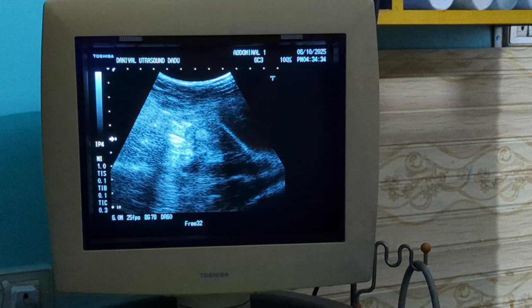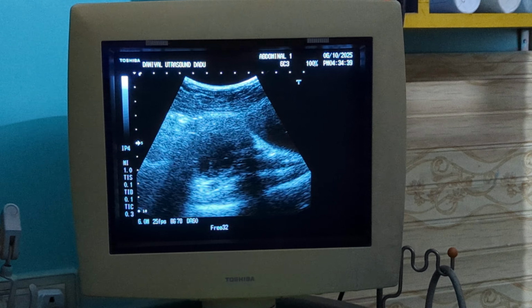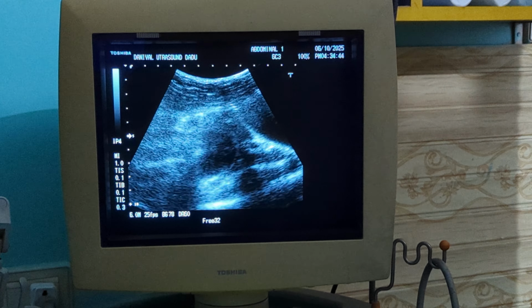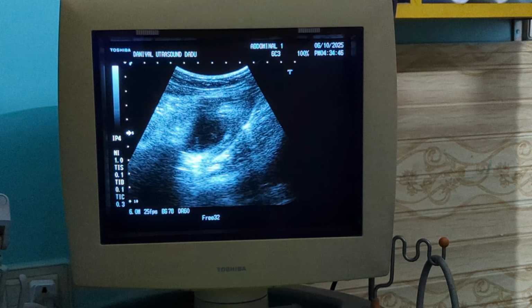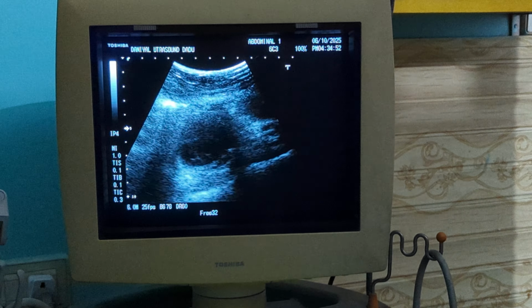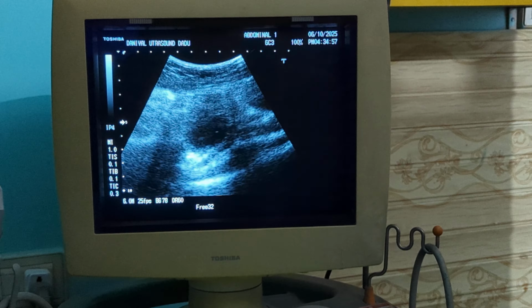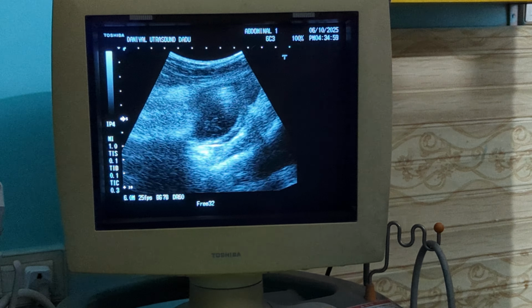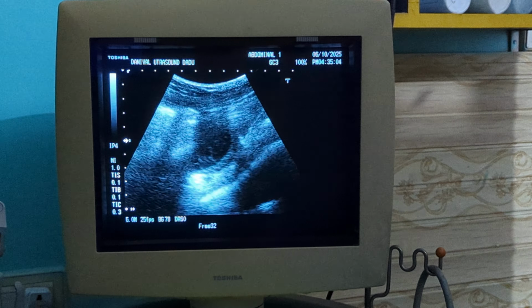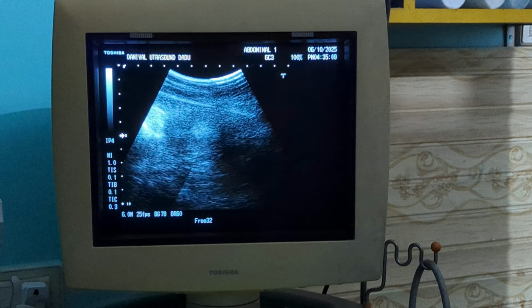Most of the gynecologists or the sonologists misinterpret these things and just write down hemorrhagic cyst or something like that, then the patient has to undergo unnecessary operation. We should refrain from this practice and go in depth through all these structures, so our patient shouldn't suffer from unnecessary burden of financial crisis or other health issues. So this is a corpus luteum cyst in the left ovary.